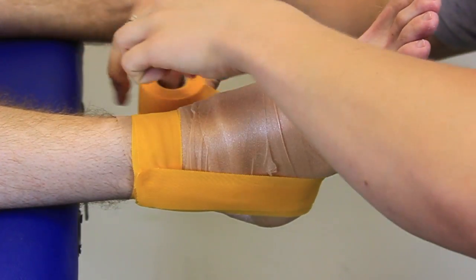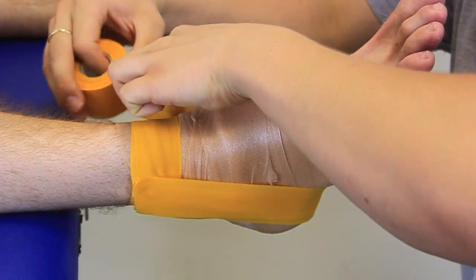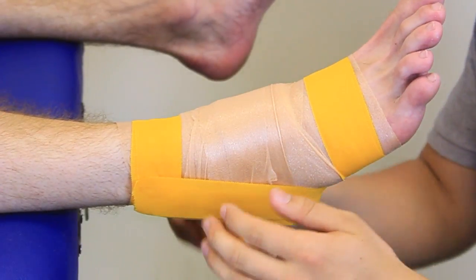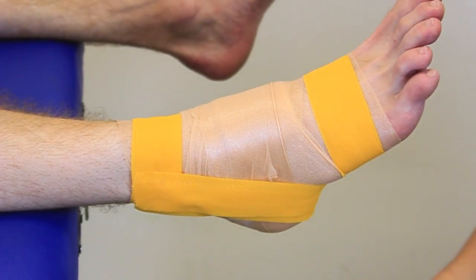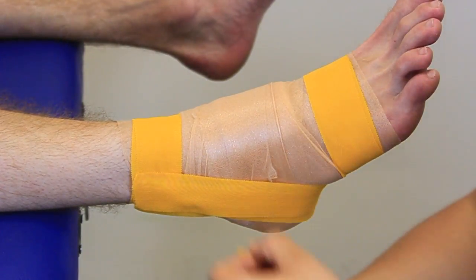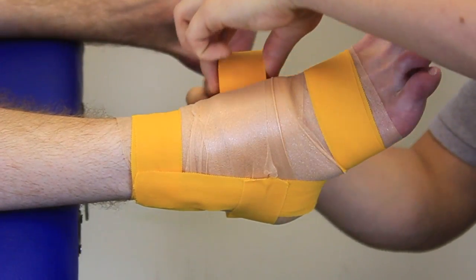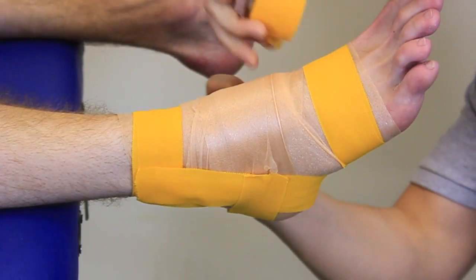We're going to perform a second stirrup, just a tiny bit off the first one — that's going to add to the strength to stop the ankle from rolling out. We're going to apply a lock around the base of the heel just so that the anchor doesn't move and neither does our stirrup.